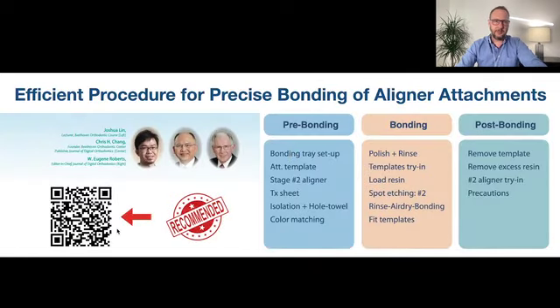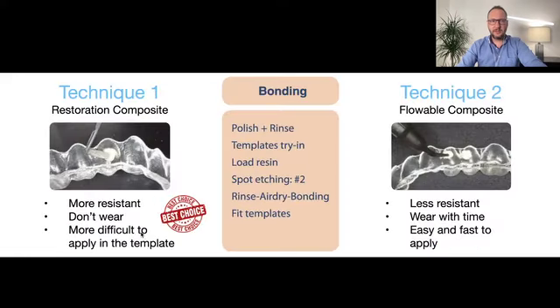And here I will suggest you, this is a very good article with Dr. Chang and his colleagues talking about an efficient way to bond attachments that I really like, okay? And they split it in 3 phases: pre-bonding, bonding, and post-bonding, okay? So I really recommend reading this article. I'm going to review it for you, okay?